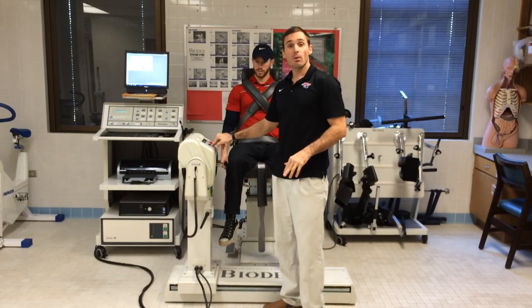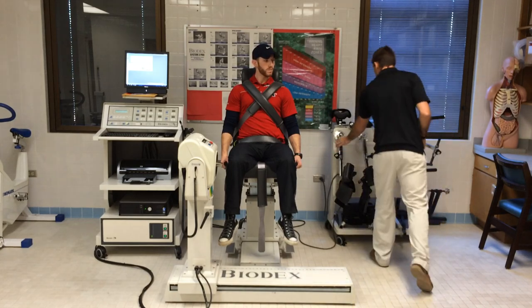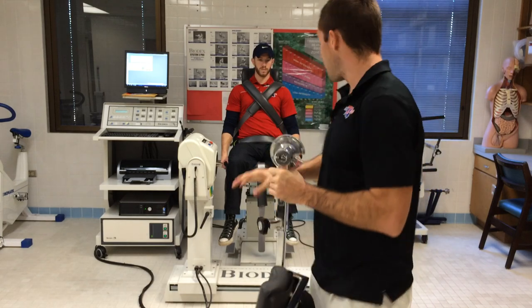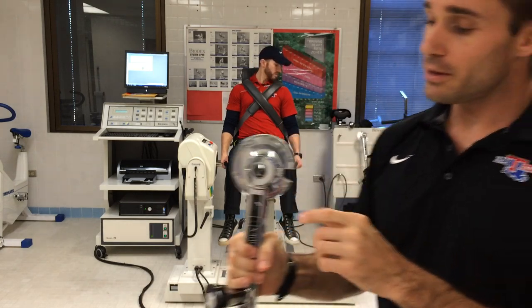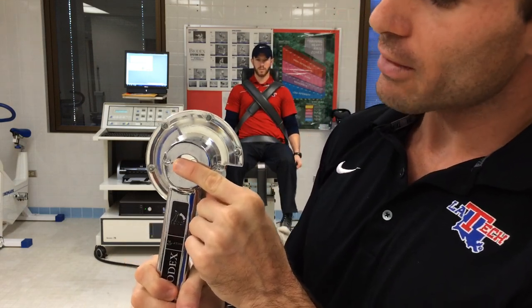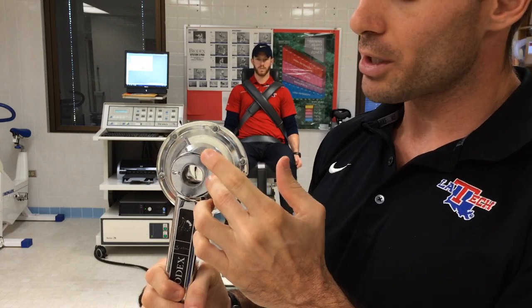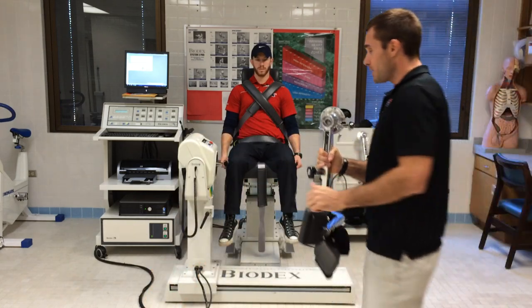So at this point, before we go to the leg, we need to make sure we've set up the dynamometer. If we look on each of the handles, you can see in our system over here, there's a ton of different connectors we can use. For the knee, you're going to see these right here. One's going to have an R, the other one's going to have an L. It's going to correspond with the leg you're supposed to be using. Since we're testing Bo's right leg, we're going to be using this piece.